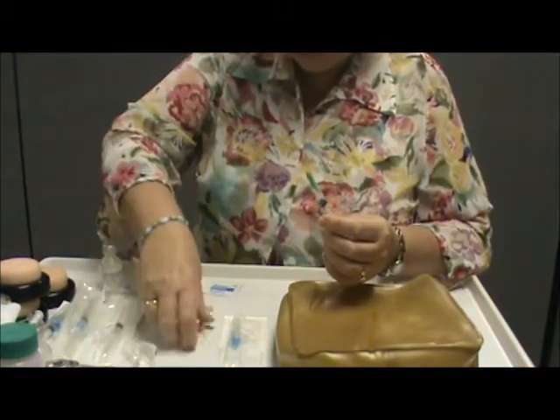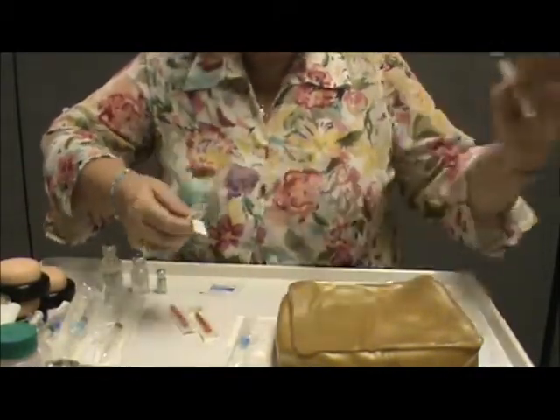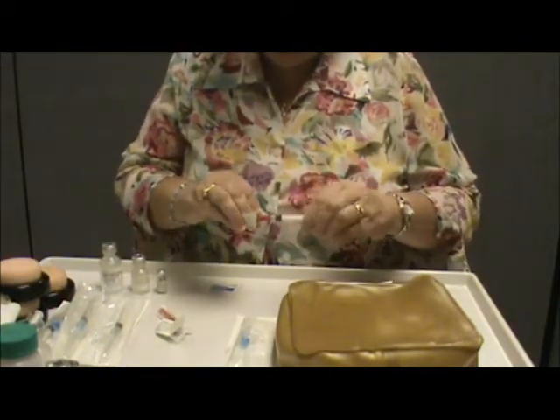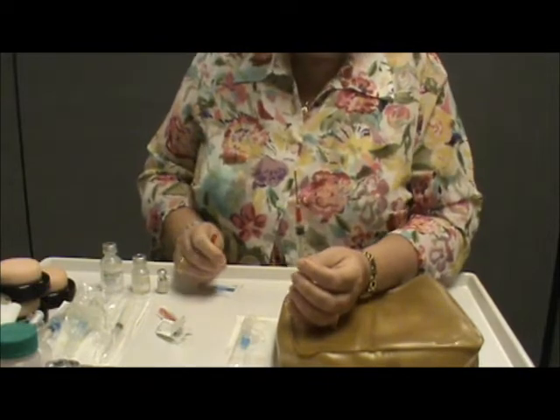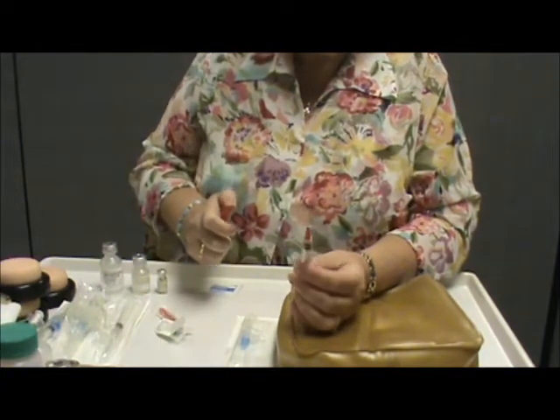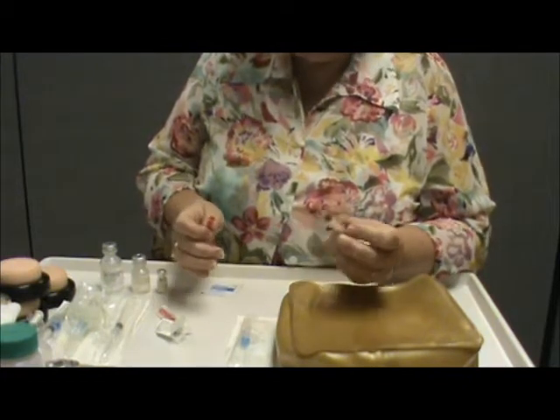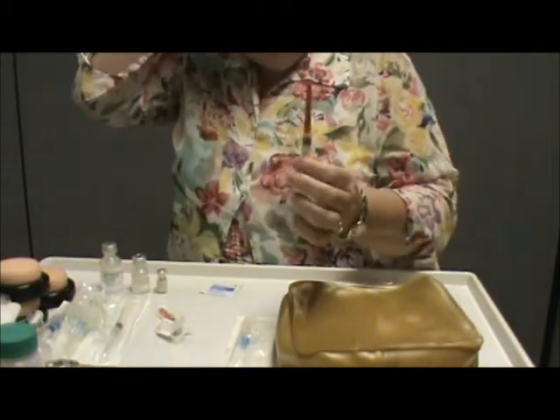Here is a blunt type needle. Whoops, I left that on there. And again, hold your paper back out of the way, attach it, and pull it off. It's like an 18 gauge, so that you can easily use it for filling. It has kind of a blunt tip on it so that you would hopefully avoid sticking yourself. And certainly for real, I would not touch that, but I just wanted to show you that it's definitely not a real sharp point. Anyway, so I've got this ready.